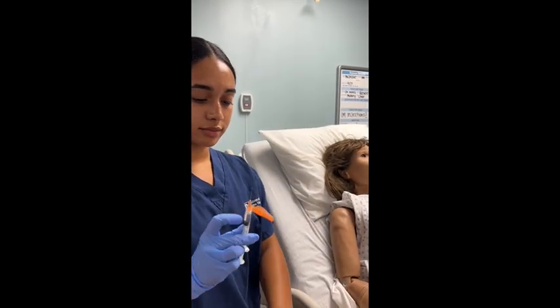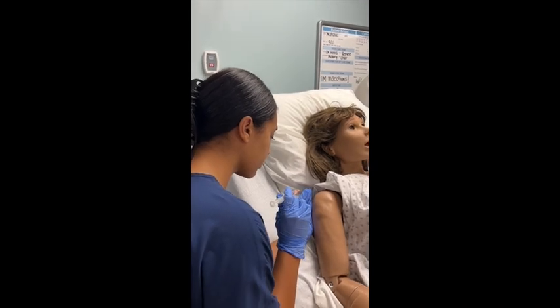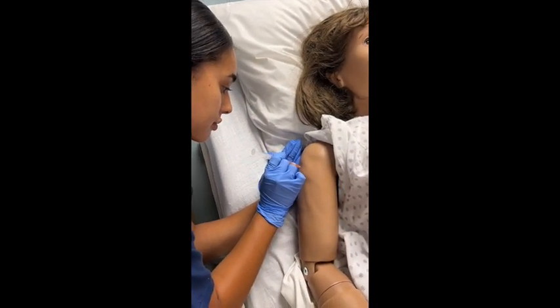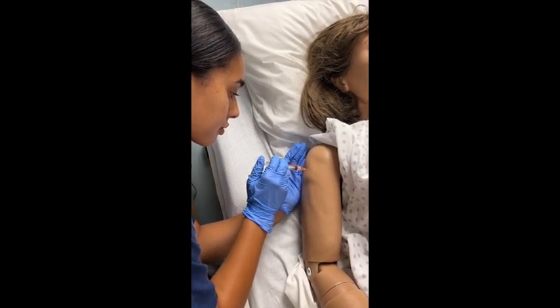Hold the needle with your dominant hand. Using your non-dominant hand, pull the skin to one side, making sure you don't swipe your glove over the area you just cleaned. Quickly inject the needle at a 90 degree angle, insert the medication, and hold the needle there for 10 seconds.